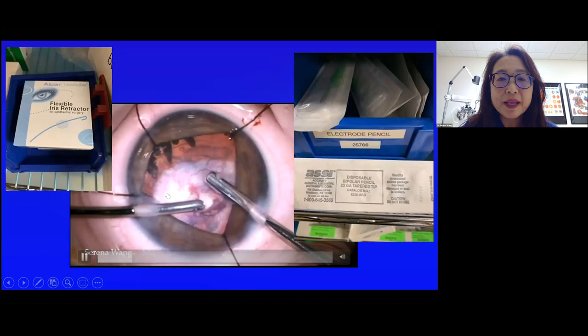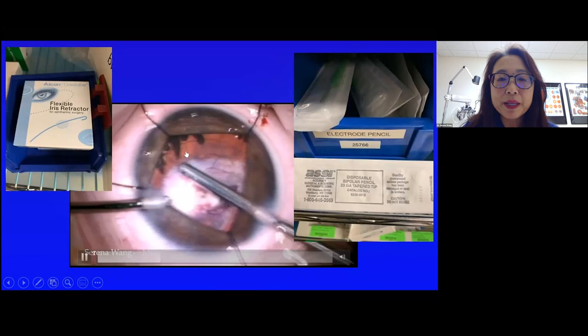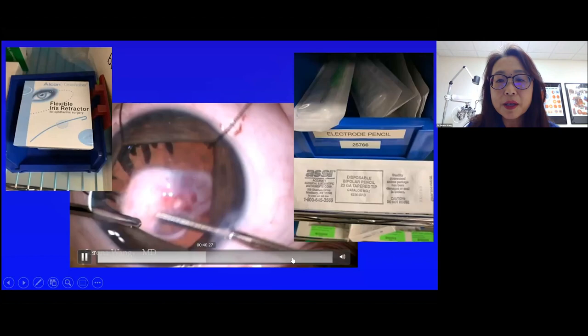I used the vitrector, open the anterior capsule, clean the cortical material. This is such a bad PFV. I wasn't planning to keep any of my lens materials there too. So I'm just showing you this quick, this is a cautery here. You can see how the cautery works, too, then you'll be tracking me.